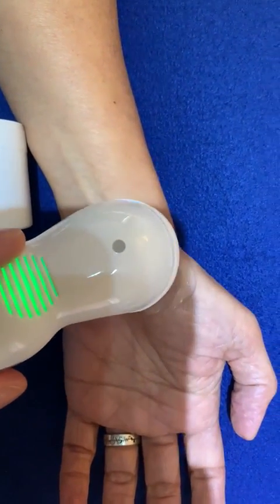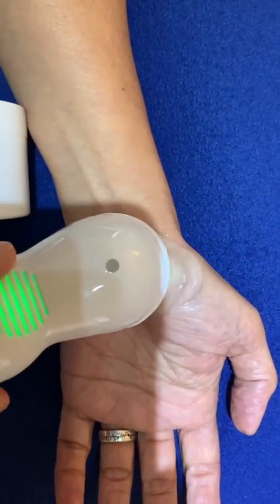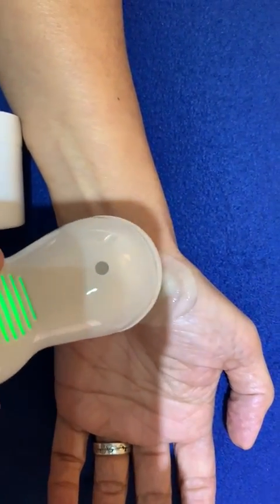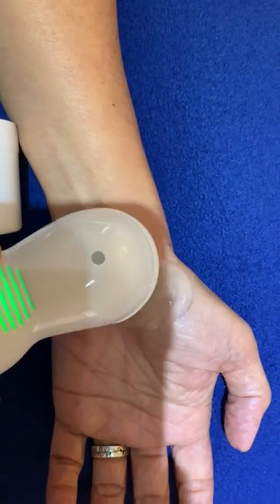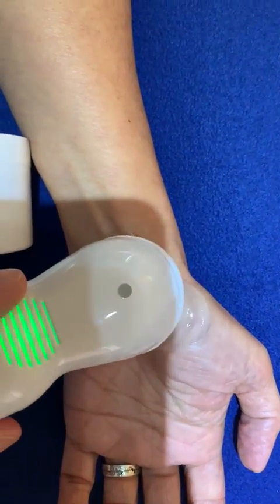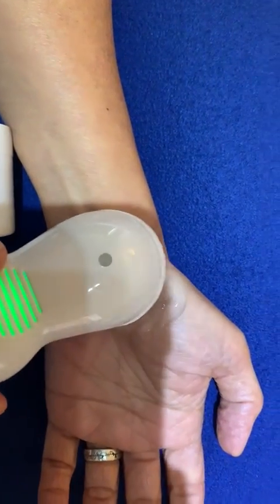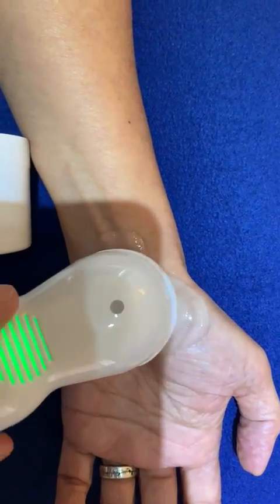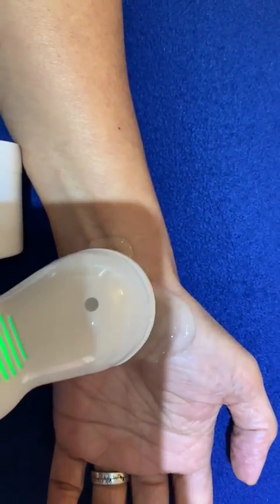The ultrasonic probe, using the process of phonophoresis, will drive the active ingredient of aloe vera into the tissues and have an anti-inflammatory effect, as well as loosening the fibrotic scar tissue in the flexor retinaculum, thereby decompressing the median nerve and easing pain.